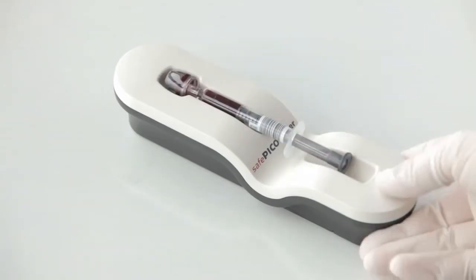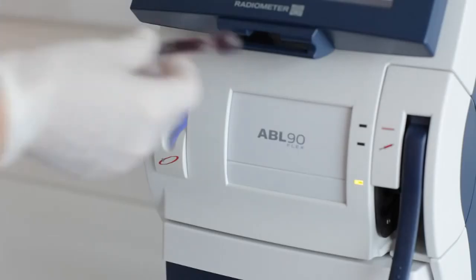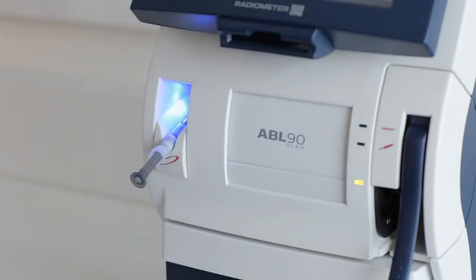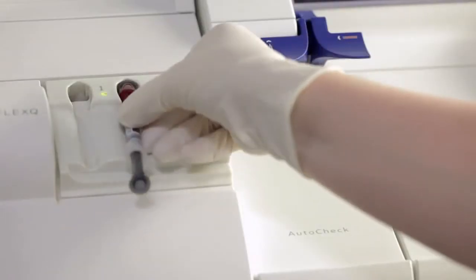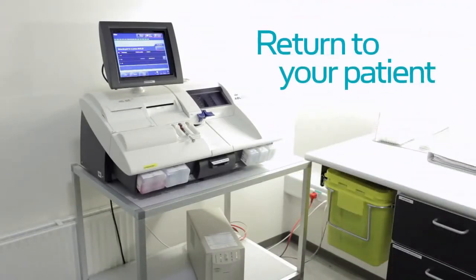First Automatic provides automatic mixing of samples. Using the sampler ID, the ABL80Flex and ABL90Flex analyzers automatically retrieve sample and patient information. On the ABL80Flex analyzer, the sample is placed on the queue. You can now return to your patient.